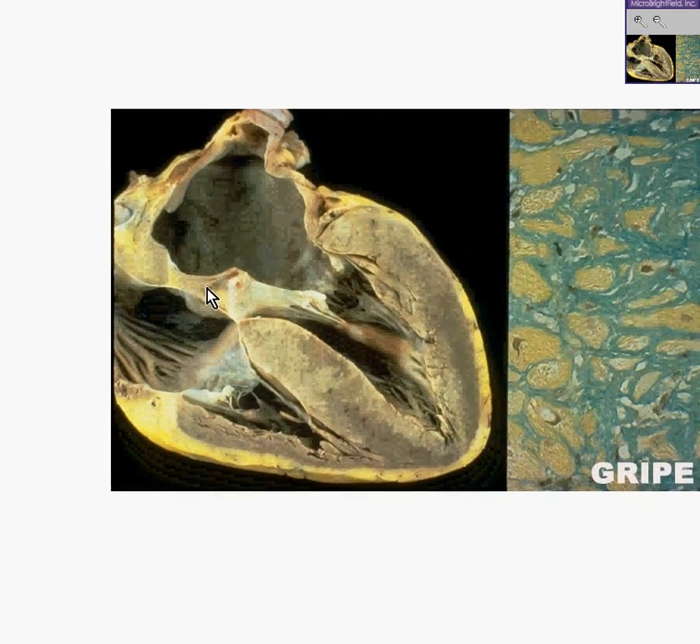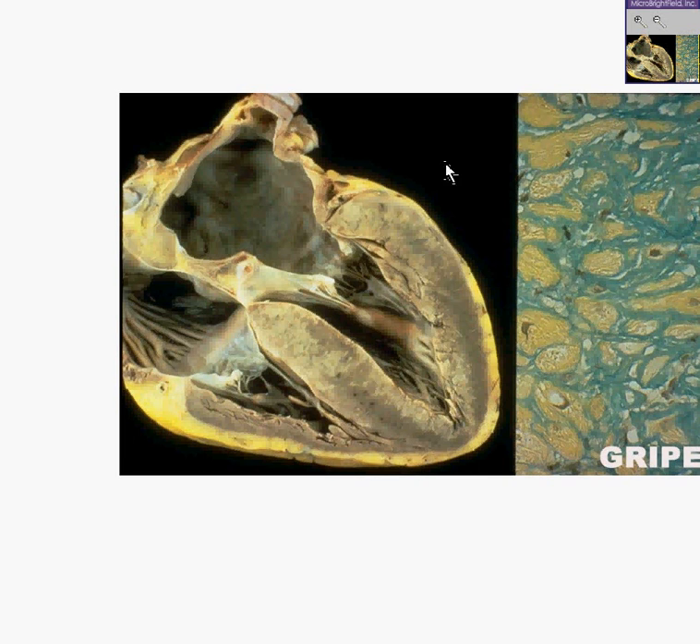Here is a very nice picture of a heart. You could see the left ventricle and its very thick wall. You could see the septum, the right ventricle, the left atrium, and the right atrium. It's one of the nicest dissections of the hearts that I've seen.